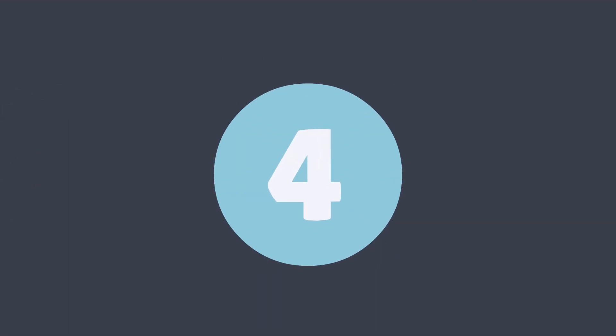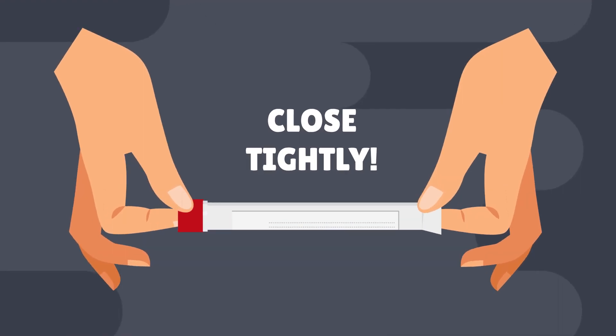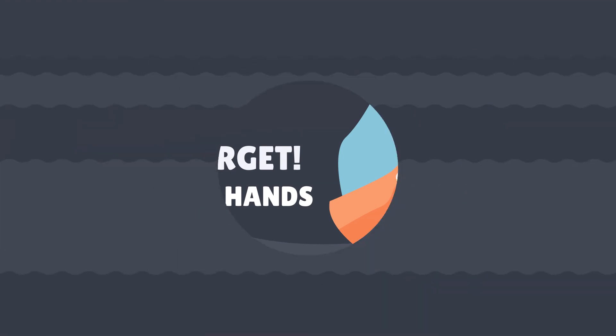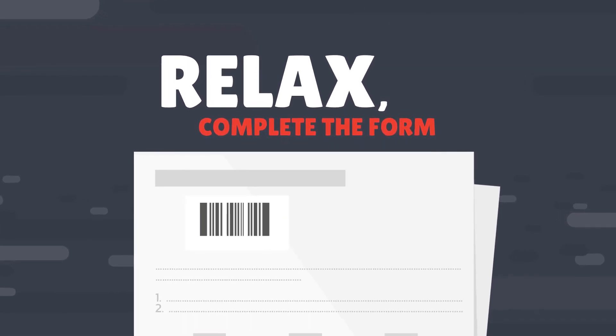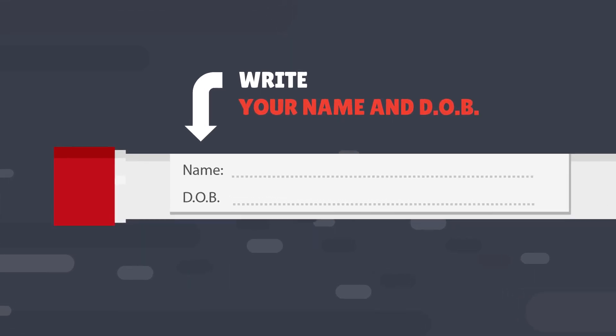Step 4. Place the used swab back in the tube and close tightly. Don't forget to wash your hands. That's the hard bit done. Now relax.